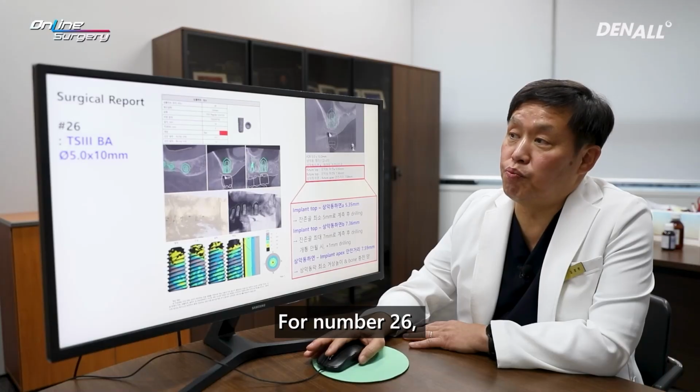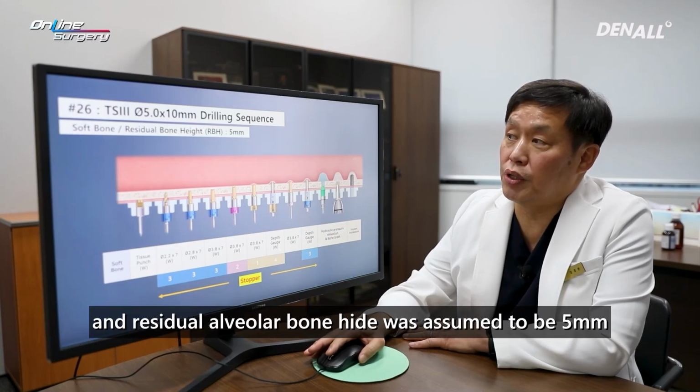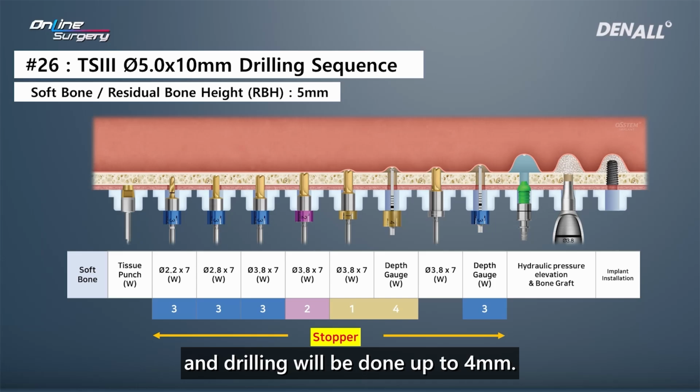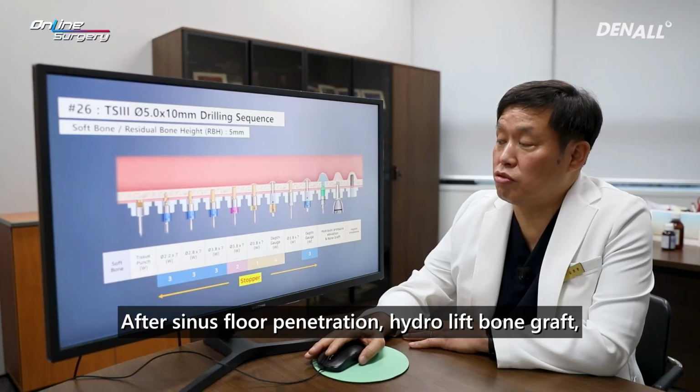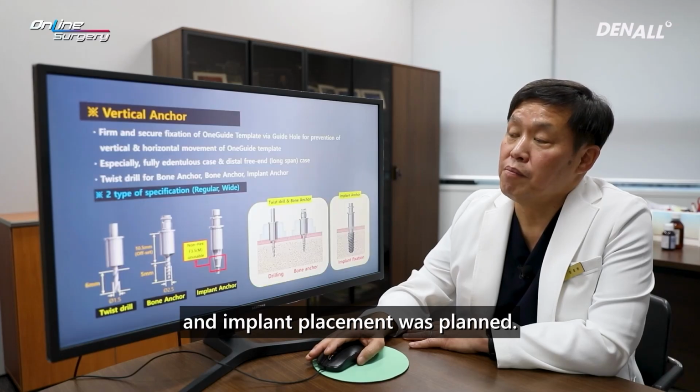For number 26, TS3 5.0 by 10 mm implant was planned, and residual alveolar bone height was assumed to be 5 mm, and drilling will be done up to 4 mm. 3 mm stopper on 7 mm drill will be used, and the drill size will be expanded to 3.8, which is the final drill size. After sinus floor penetration, hydrolift, bone graft, and implant placement was planned.